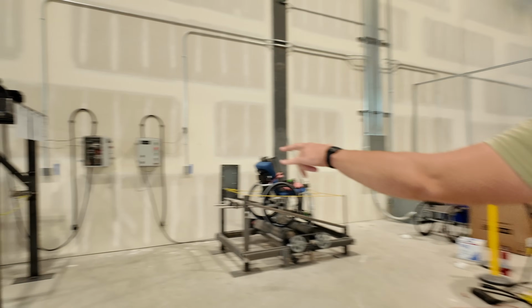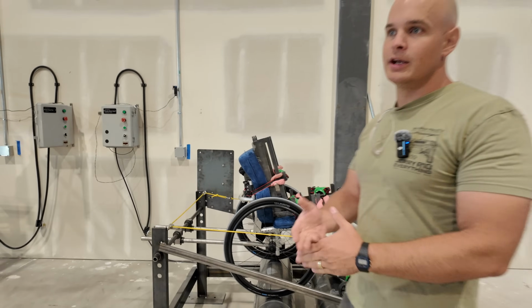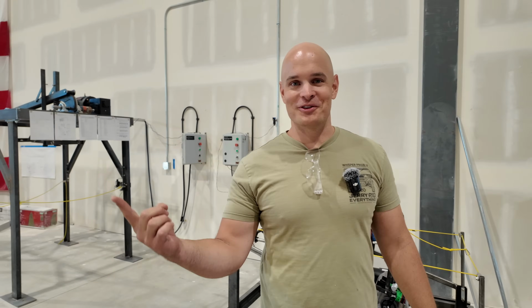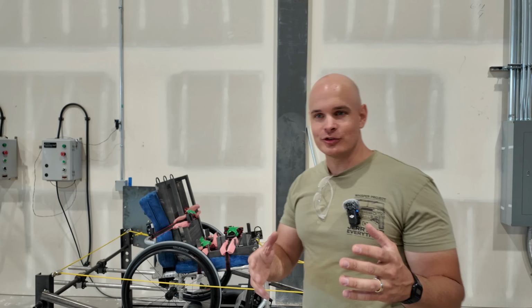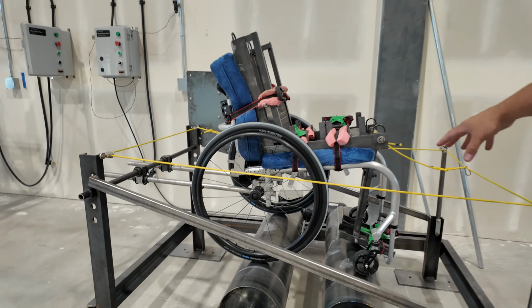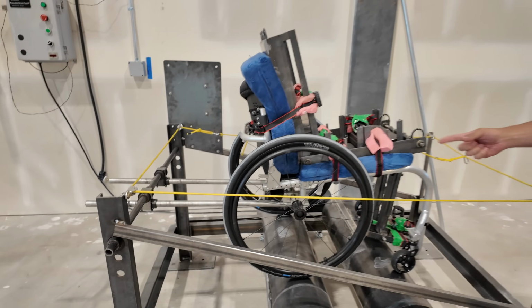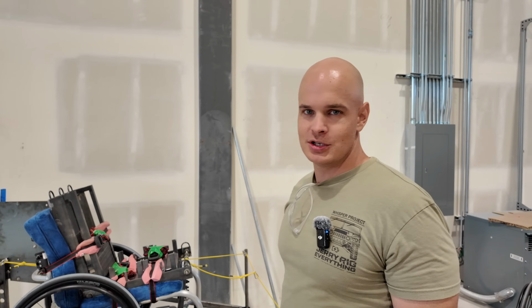And it's wild. So these are our durability testing machines, because we want to build inexpensive wheelchairs, but we also want them to be super durable. And so we have built these durability testing machines. This is a roller machine that basically simulates about 5 years worth of abuse as it's rolling on these drums. It's a drum rolling durability test machine.